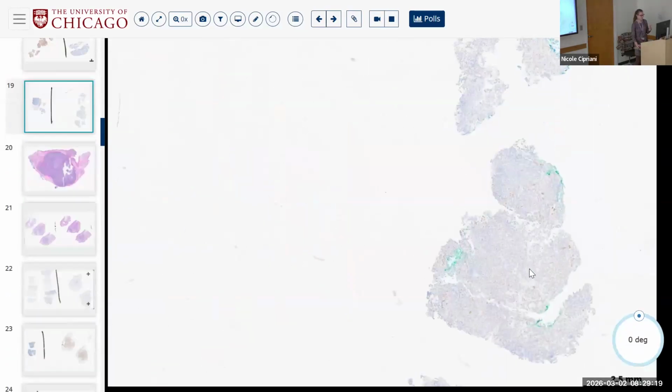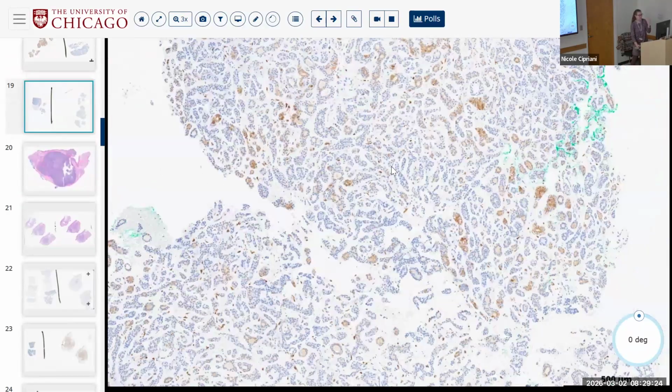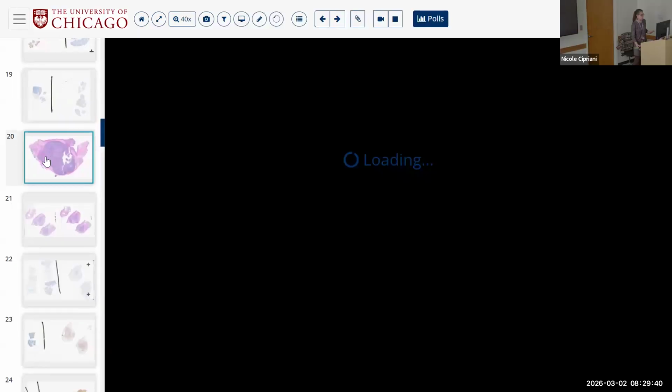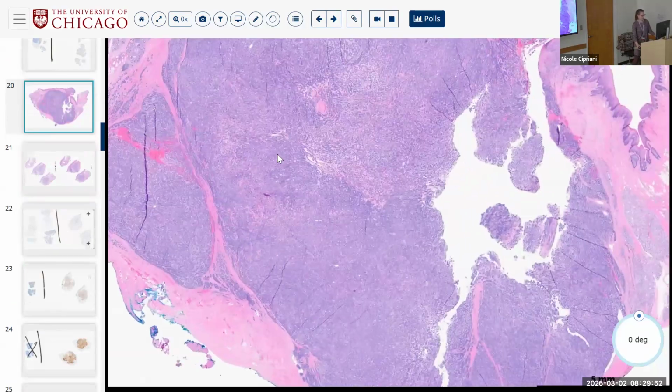And then S100, in this case, is not helpful. There's no population here that's specifically S100 positive or specifically S100 negative. It's just randomly there. And importantly, there's nothing that's S100 positive going on in the background stroma. We'll see why that's important maybe later. So if you said, this is a basaloid biphasic salivary neoplasm, I'm going to send the MYB-NFIB fusion, in this case you'd be lucky because it would have been positive.